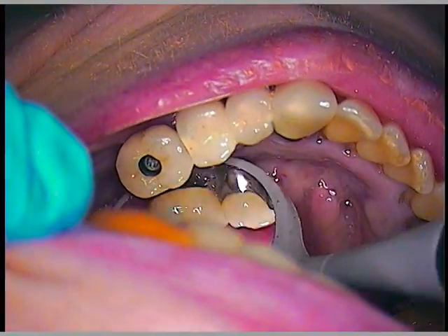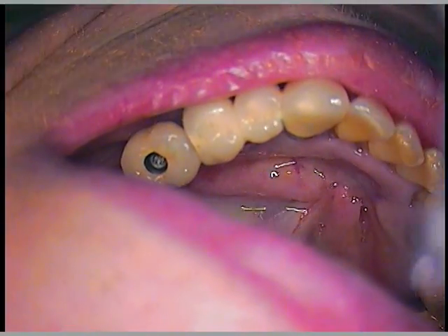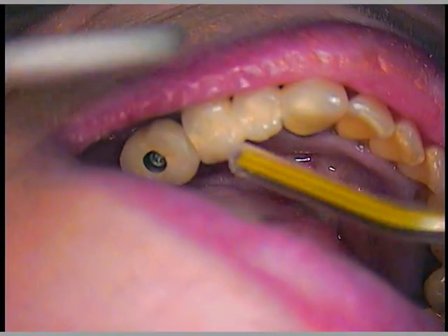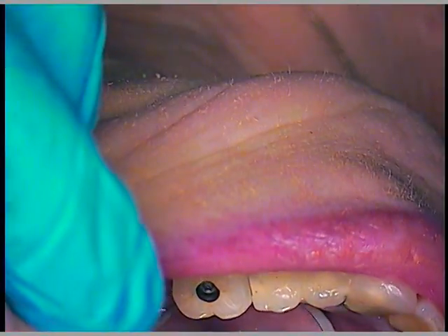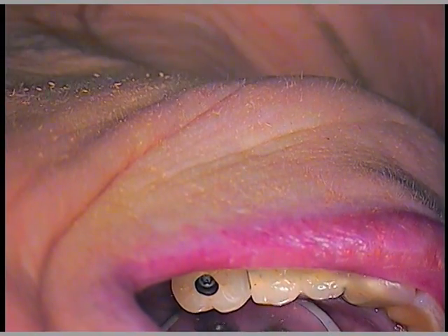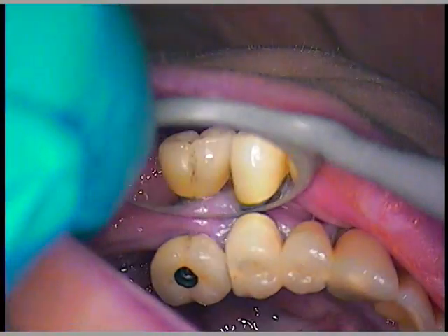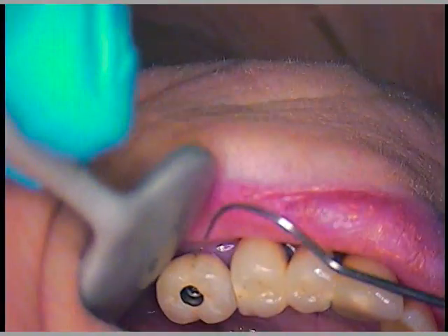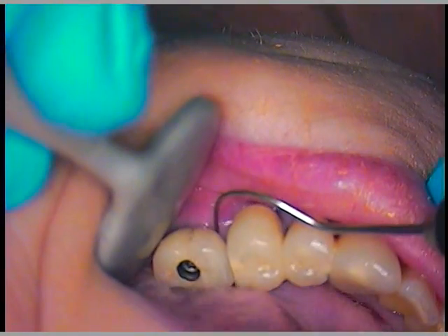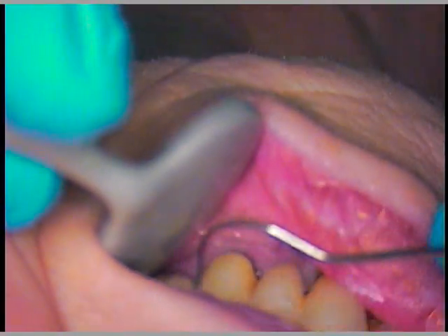I'm just going to see if we're impinging anywhere. Let me go ahead and dry your lingual. Turn toward me — I just want to examine this lingual aspect. I'm on tissue a little bit on the mesial, so you might be feeling where that's occurring. I'm going to place an instrument there so you know — right there — that's the gum tissue. That's the problem, more or less.